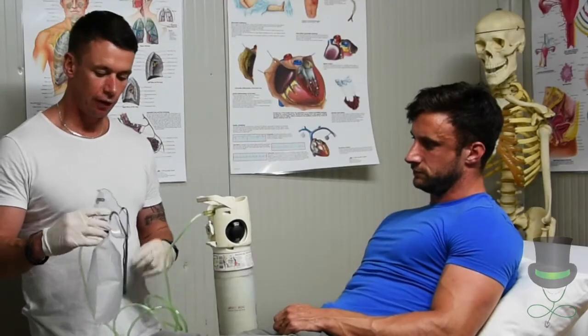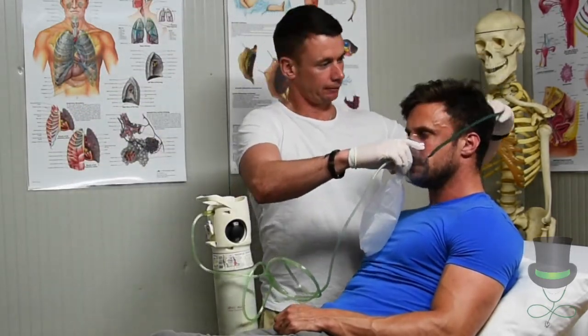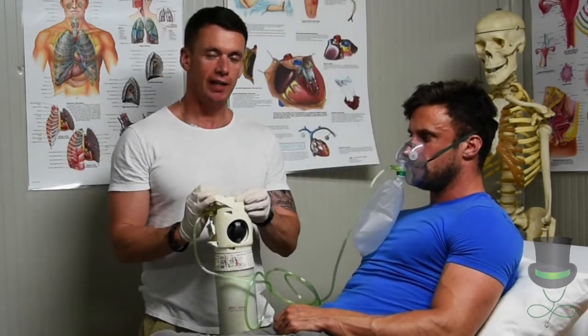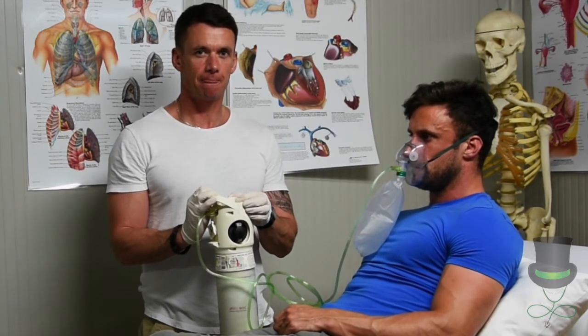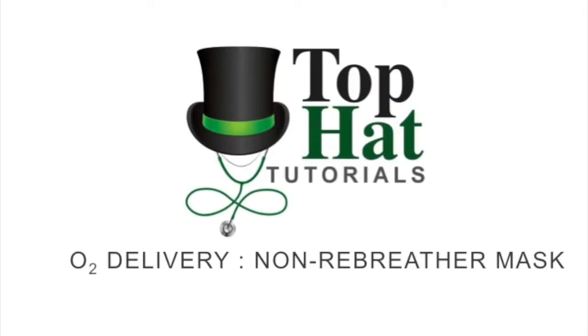When the bag is full, apply your mask over the head of the patient. You can then adjust the oxygen to the required level that's needed. Thank you.